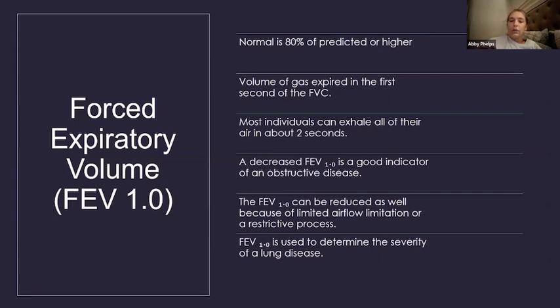A decreased FEV1 is a good indicator of obstructive lung disease. The FEV1 can be reduced as well because of airflow limitation or a restrictive process. And the FEV1 is used to determine the severity of a lung disease.